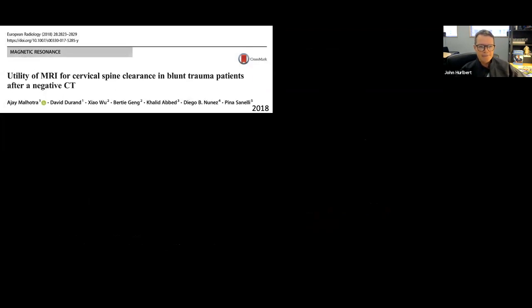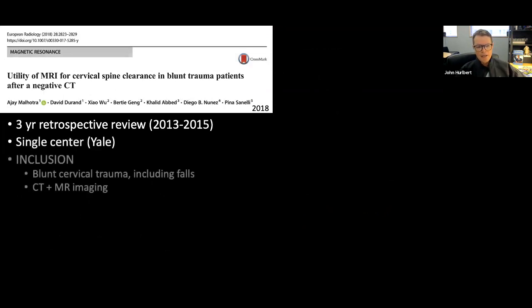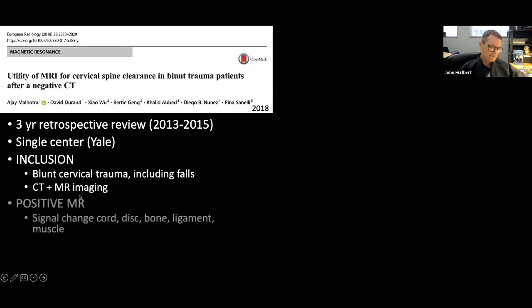Second paper, 2018, it's Malhotra. He's a very prominent radiologist, and it's a 3-year retrospective review from 2013 to 2015 at a single center in Yale. He's still there, still practicing, still writing. The inclusion criteria were blunt cervical trauma, including falls. CT was used along with MR imaging, and a positive MRI was included as positive if there was signal change in the cord, the disc, the bone, the ligament or muscle. So anything positive on the MRI was positive.